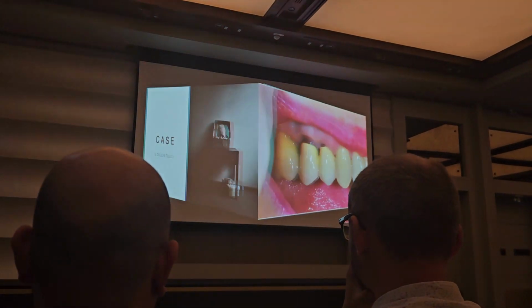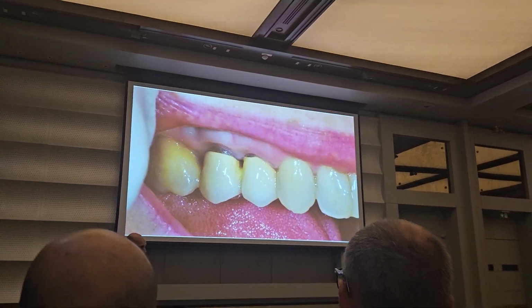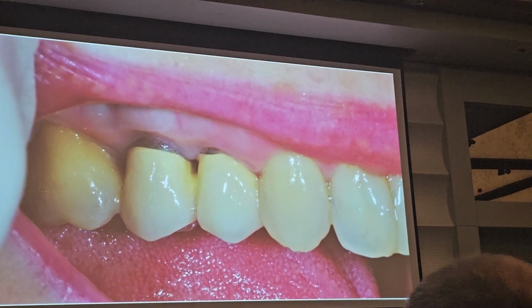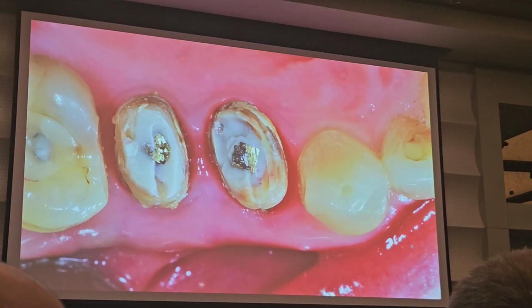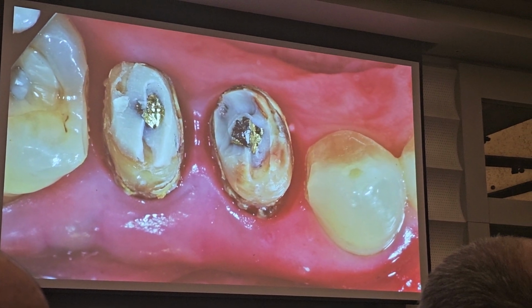This is another double fiasco. The patient asked me to improve the cosmetics. Okay, I advised them that I cannot improve the biology, the biomechanics. I can improve the cosmetics. This is what I did. I removed the crowns. I redid the post. I redid the build-up.